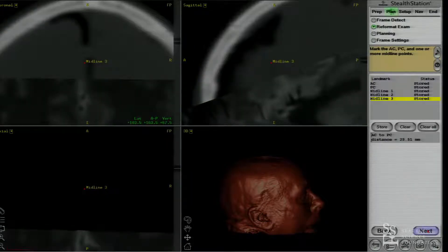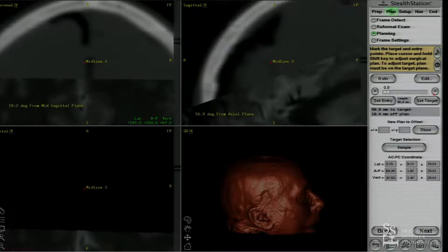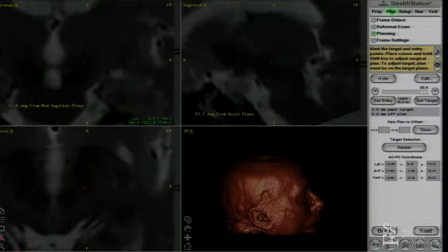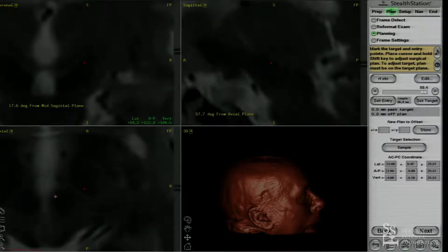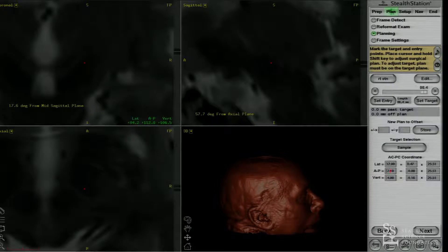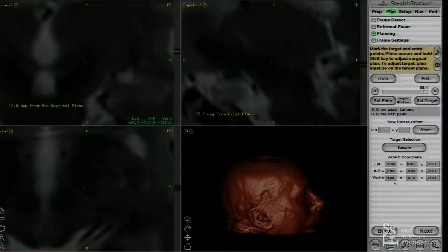I think what we're going to do here is a right subthalamic nucleus. That's our left side. So here I've used the direct targeting. This is a red nucleus. There's a subthalamic nucleus. We're at 12 millimeters laterally here. I'll round up to the nearest quarter millimeter — whatever difference that makes, I think it does make a difference. Two millimeters behind the mid-commissural point and four millimeters deep. So that's our target.